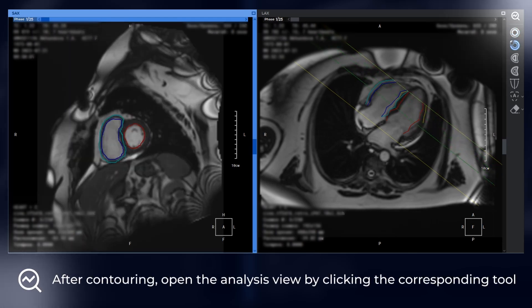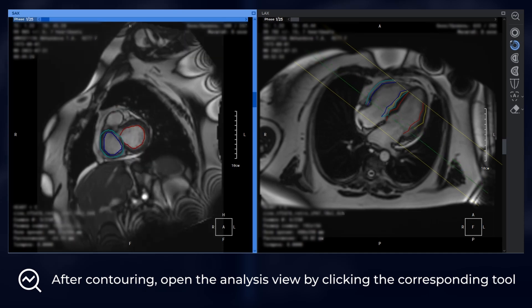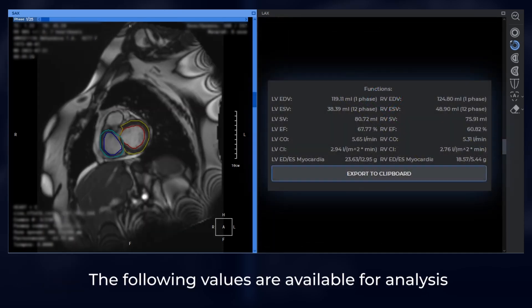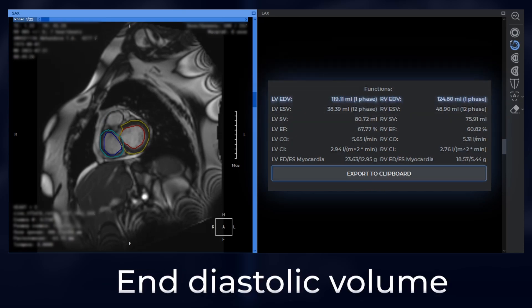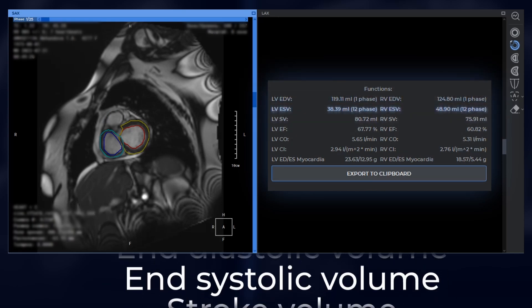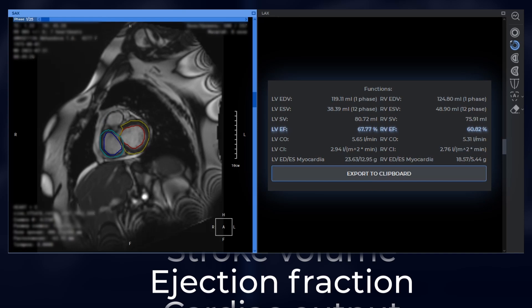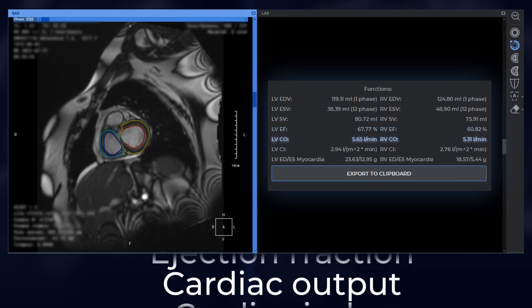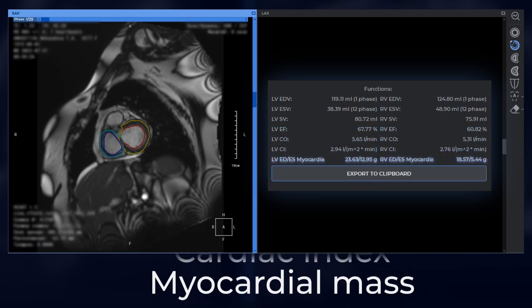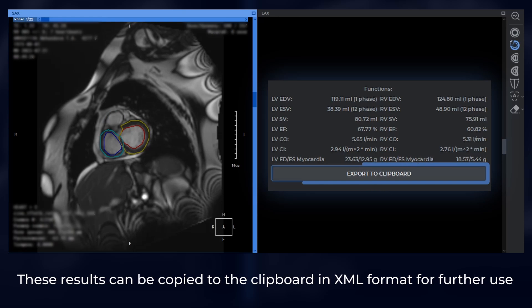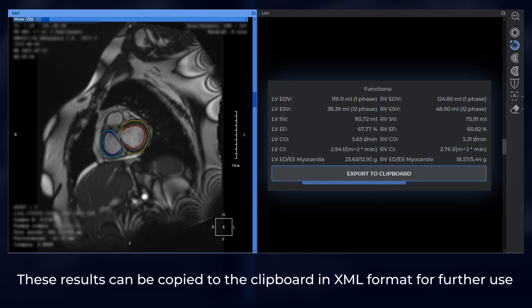After contouring, open the analysis view by clicking the corresponding tool. The following values are available for analysis: end diastolic volume, end systolic volume, stroke volume, ejection fraction, cardiac output, cardiac index, and myocardial mass. These results can be copied to the clipboard in XML format for further use.